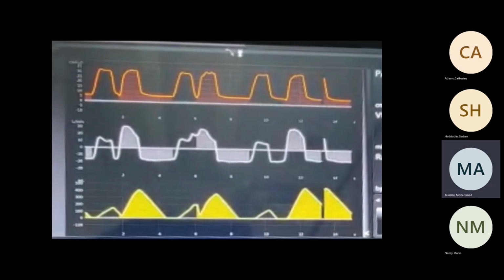Mahmoud, because you answered this one, is it pressure control or volume control? Pressure control, CMV. So why did you say pressure control? Because the pressure waves are the same and there is a difference in the flow. So the flow is not stable, is that right? Yes, the flow is not the same in each one. Before, this is a volume, that's a pressure control. Yes.